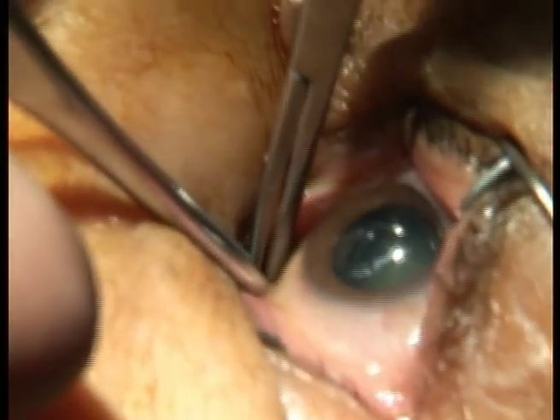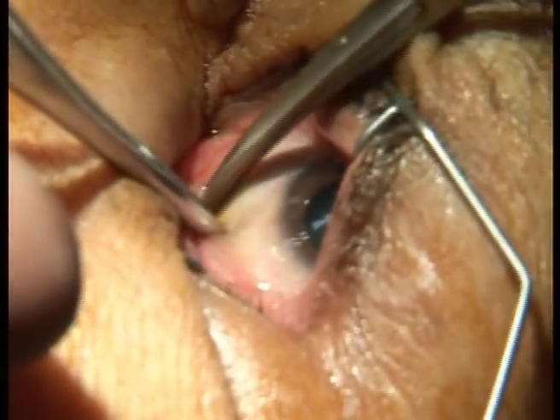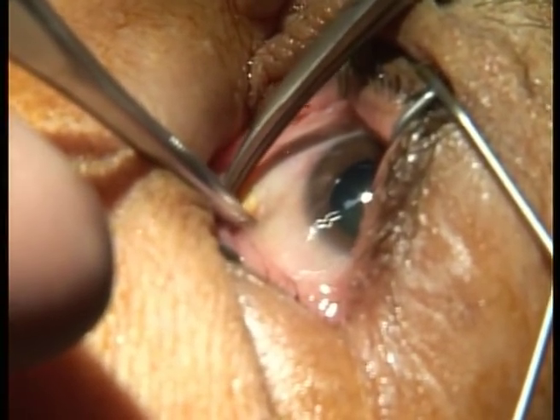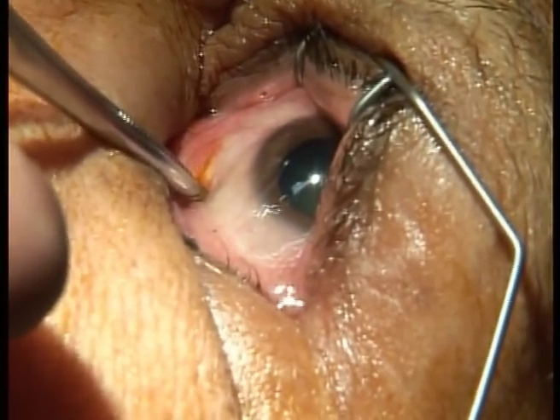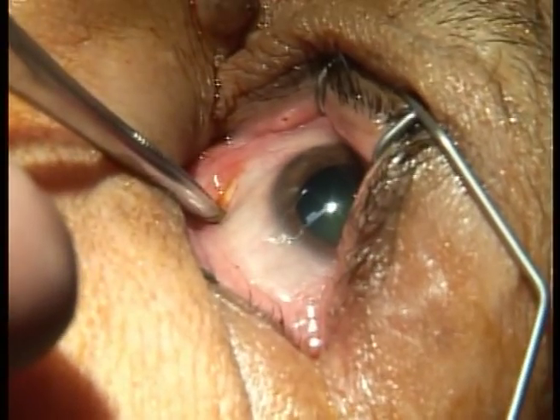Look across to me, Jennifer. And there I just felt that loss of resistance. And there you can see the difference in colour. So you can actually see the plane that I've got into. And now again note how my forceps are resting on the patient's globe. I never lift them up off the globe, which creates a big tear.